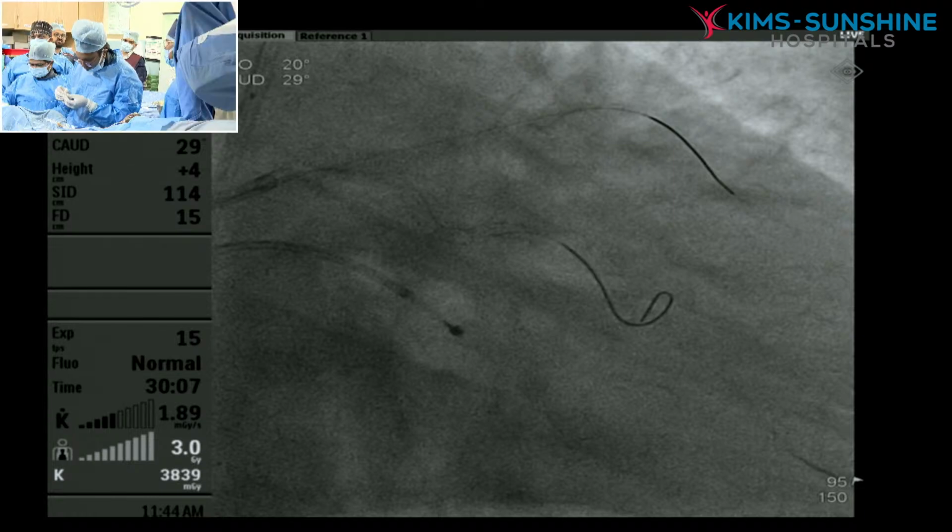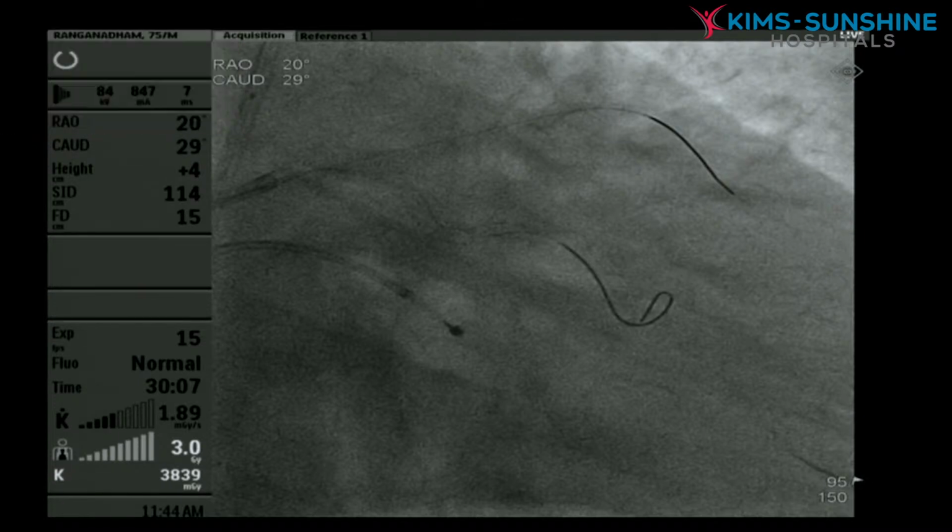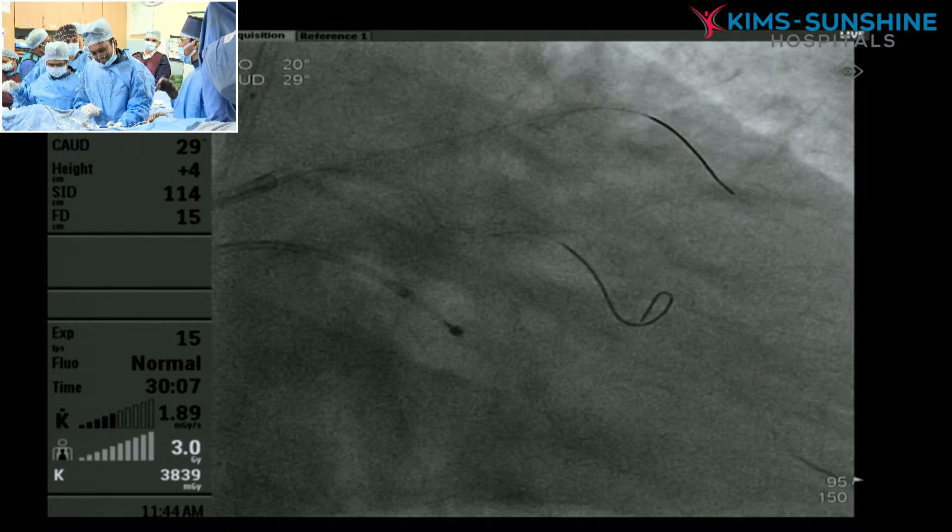Nicely. Original gain also very good after ROTA. Don't praise it too much. He will have a sleepless night today.